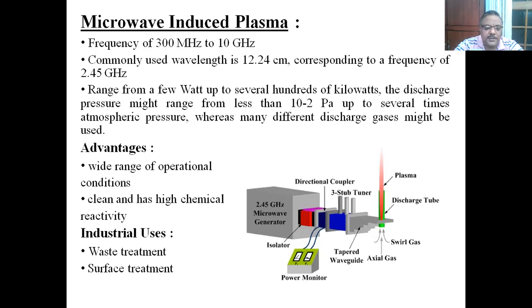The advantages are the wide range of the operational conditions due to a vast range of the pressure and the frequency, and the clean, high chemical activity. It is used in waste treatment and surface treatment.